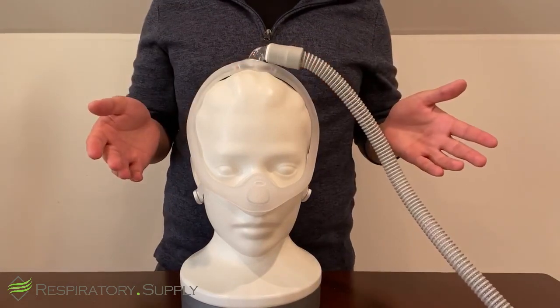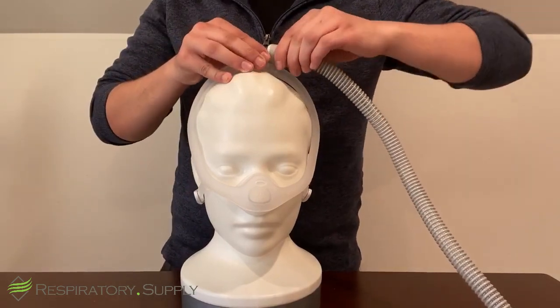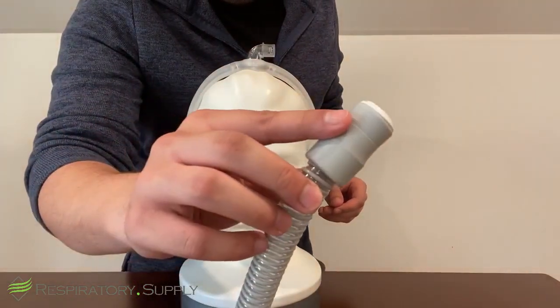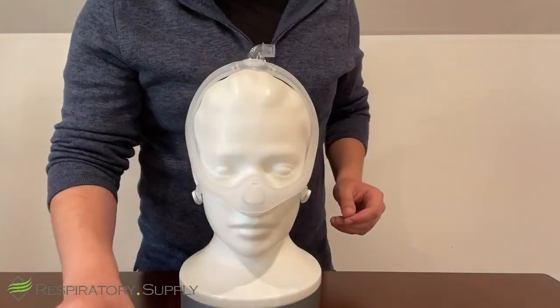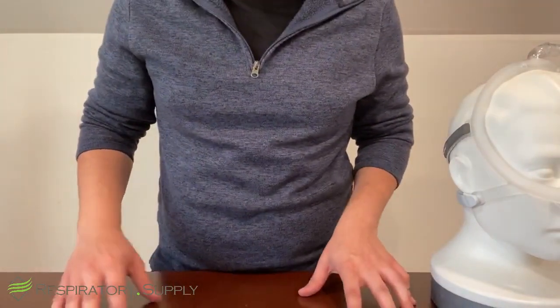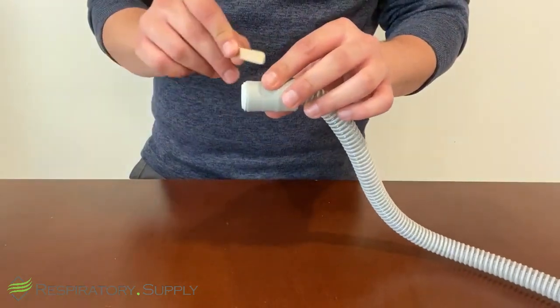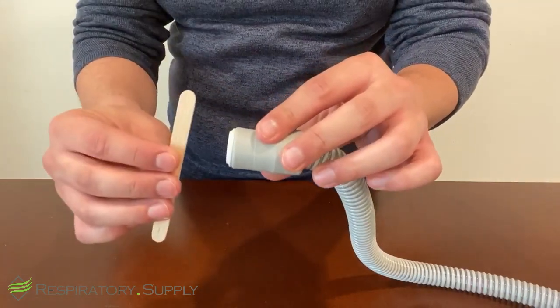But now we're faced with a different problem. What if the connector is not so easy to remove? Well, this is an excellent example here. As you can see, the connector is now lodged in the end, and this one does not have nearly as much extension beyond the rubber, making it much harder to grip. Luckily, I have a self-developed tool that makes it a lot easier to get it out, which I will show you here in just a moment. So with the DreamWisp connector, as we've already identified, it is a lot smaller than the Vitara. It does not extend nearly as far out.